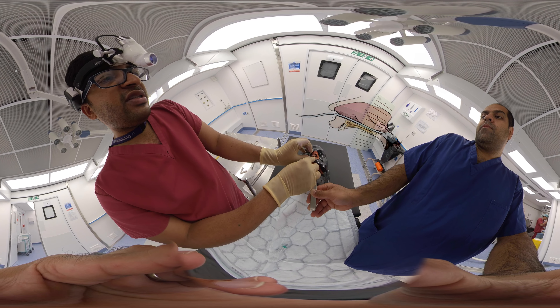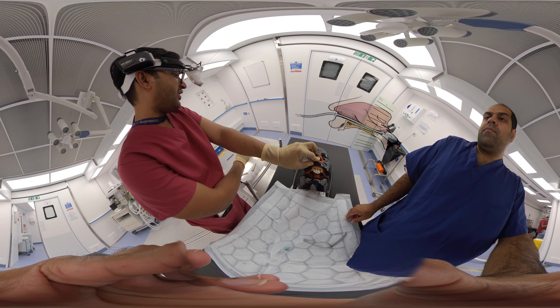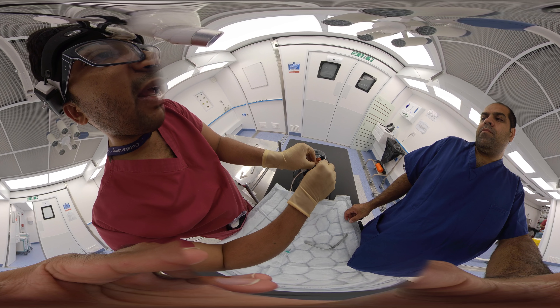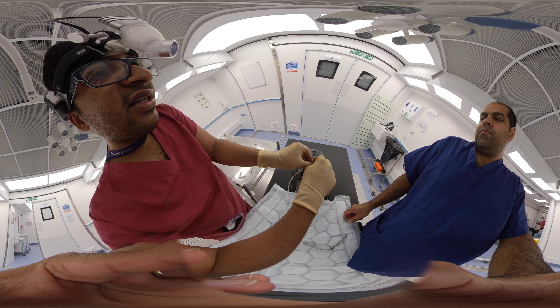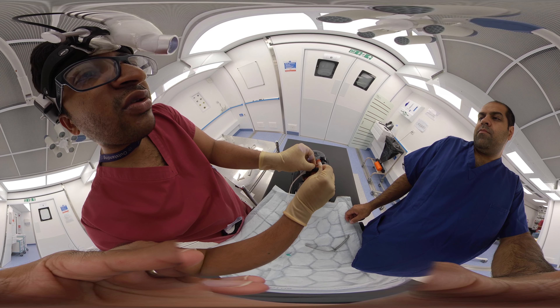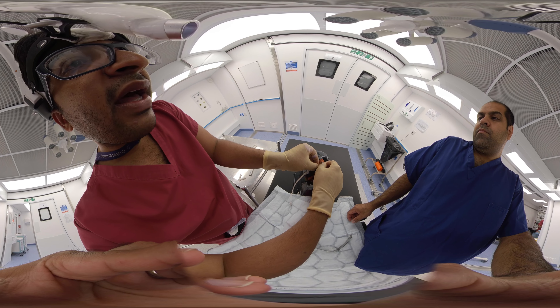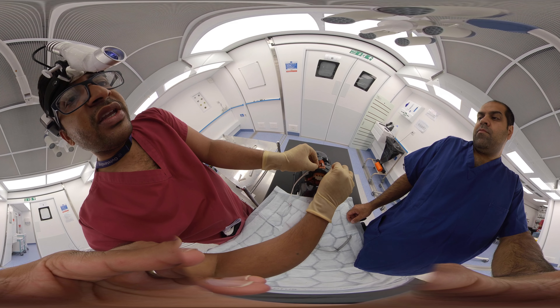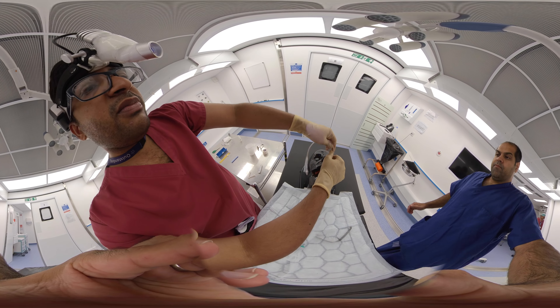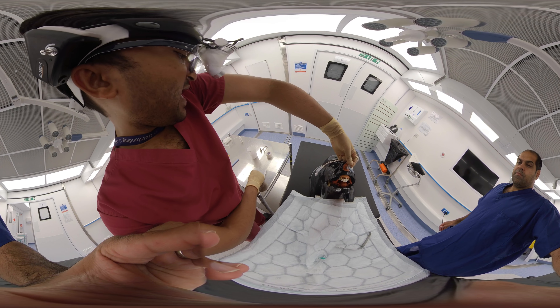Once post-nasal packing is done, before securing it we also have to do anterior nasal packing. I'll take the rapid rhino and gently introduce it along the side of the post-nasal pack — it should be generously lubricated — and then slowly push it all along parallel to the post-nasal space.